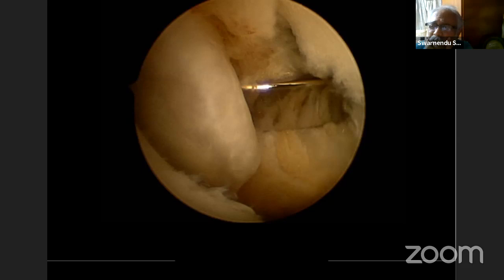Okay, first, I must say I don't do a lot of ankle arthrodesis. For me, if I do an arthroscopic ankle arthrodesis, it's really somebody with minimal deformity, no bone loss. It means something that's fairly easy to do. I still prefer to put a home run screw. That means in the front, I would have at least one medial screw. If I can get a lateral screw also, but then I also try to put a home run screw, that means from posterolateral into the talar neck. It's not that easy to put, but I think it gives a lot more stability.